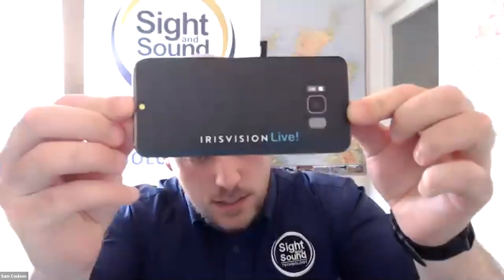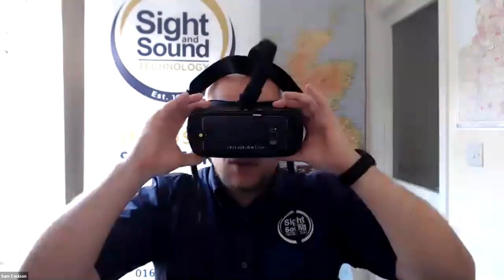But what Iris Vision have done is they've adapted the Android phone. They've put their software onto the Android phone, which controls all of the features and functions. And there's a dock on the side of the headset which allows you to place the phone into the headset, and obviously you pop it on. And you can magnify with this.